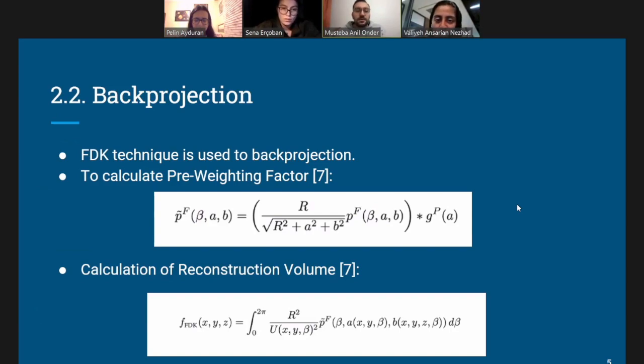In FDK for cone beam CT, the X-ray source and detector rotate around the patient, creating a conical X-ray beam that passes through the patient. The FDK algorithm takes into account the conical nature of the X-ray beam in order to reconstruct an accurate image of the patient.